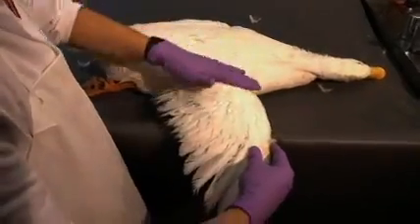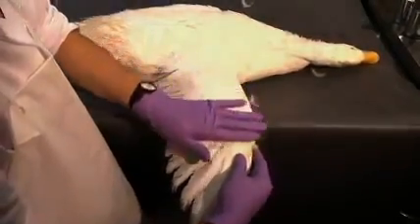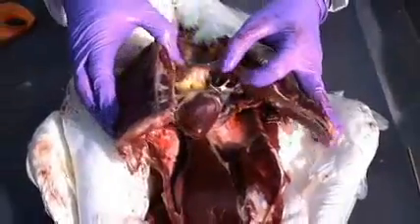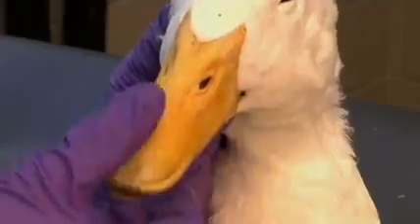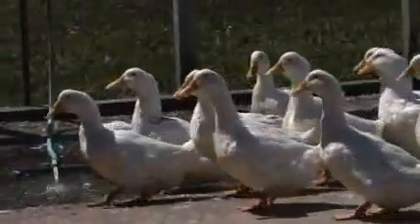The post-mortem examination of ducks is very similar to the procedure described for chickens. This session will focus on the key anatomic and clinical differences relevant to ducks. During the external examination of the head, inspect the bill. The conformation of the duck's bill is adapted to aquatic feeding.